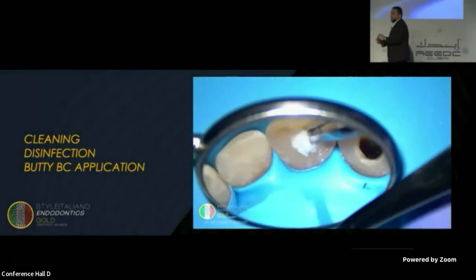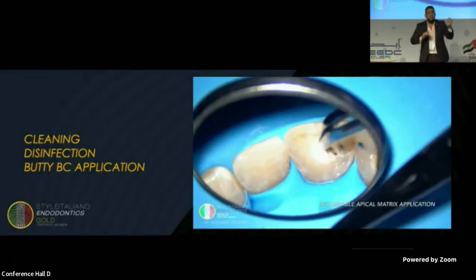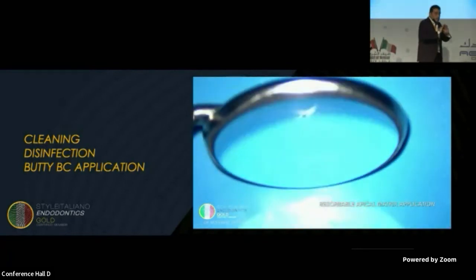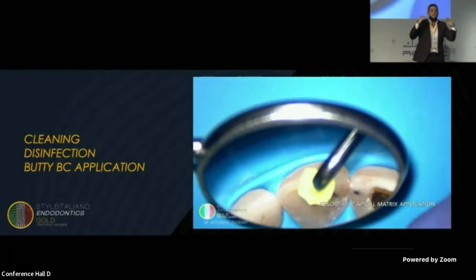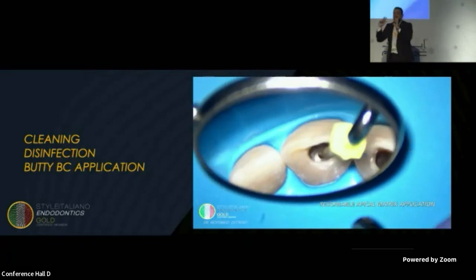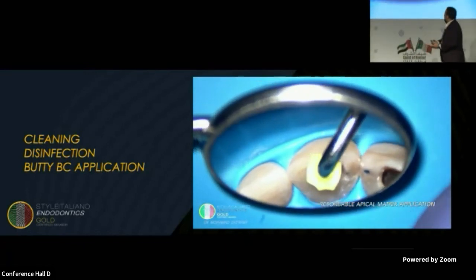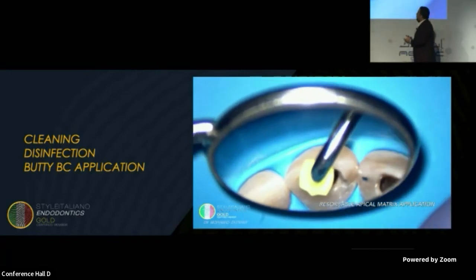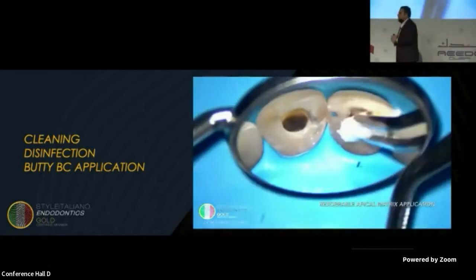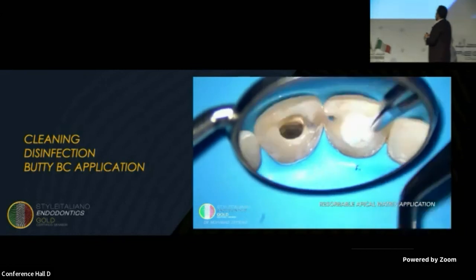Here, I will place a collagen matrix or collagen sponge. A sponge which we need to push beyond the apex or below the margins, so it will act as a matrix. So when you place your MTA or putty ceramic, you will have good adaptation at the apex, and you don't have over-extrusion of the material. Now I placed the resorbable matrix. It actually takes 2-3 weeks to resorb. Same for the second canal.